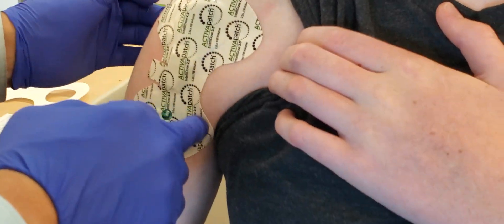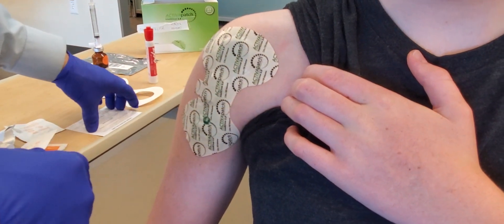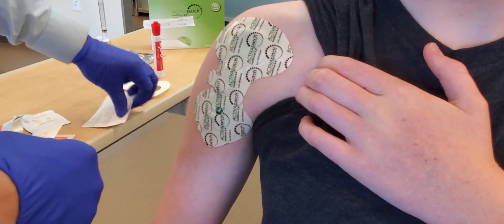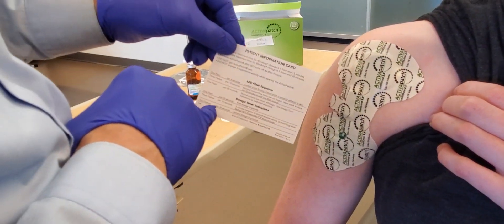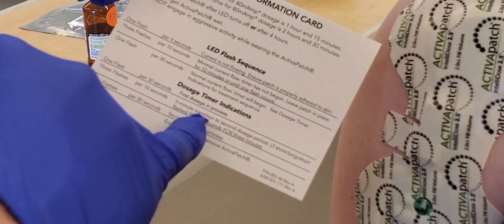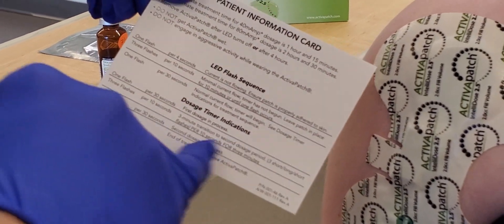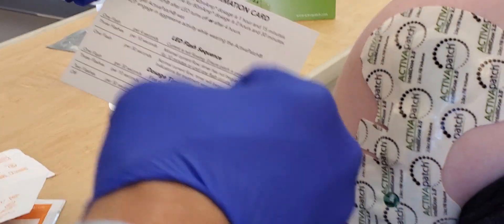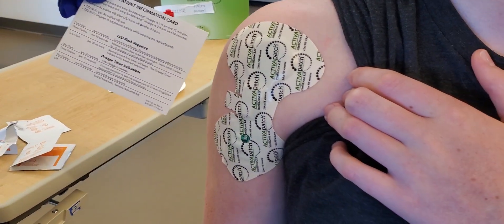Once the medication begins, the green light will be blinking every 30 seconds and will do so for the next four hours — the little card tells us that. Three flashes per 10 seconds marks the transition to the second dosage period. It may take a moment before it actually falls into the cycle, but this one's looking good, and that's how you administer it.